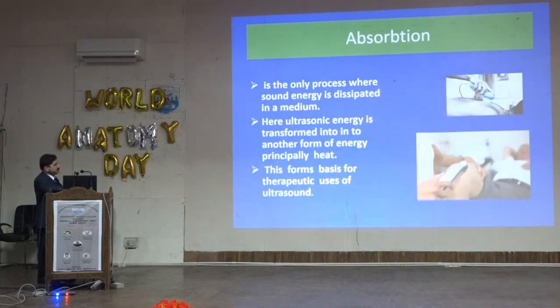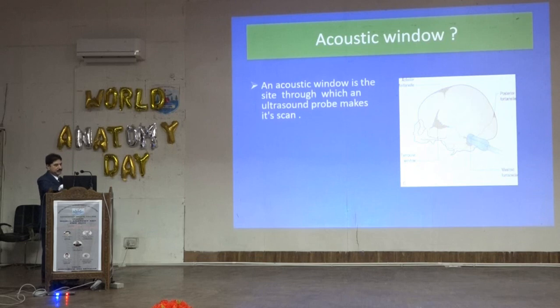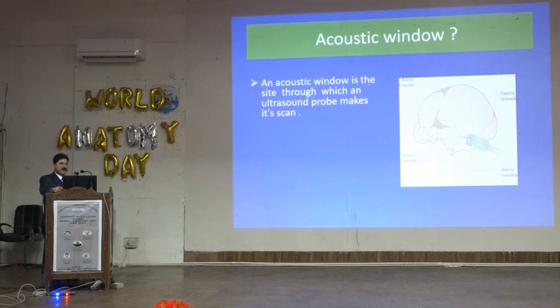Which is used in the treatment of arthritis, and it is also used for the treatment of low back pain. Now what is an acoustic window? An acoustic window is the site through which an ultrasound probe makes its scan.